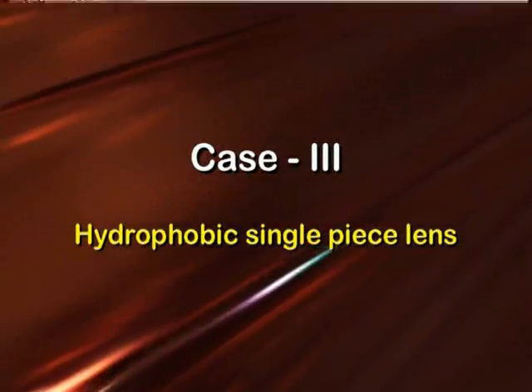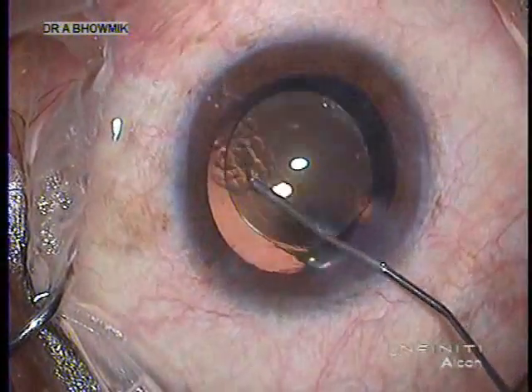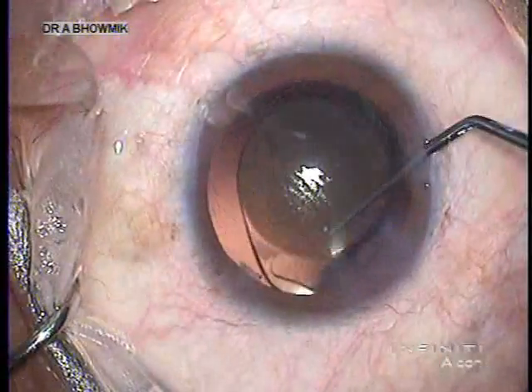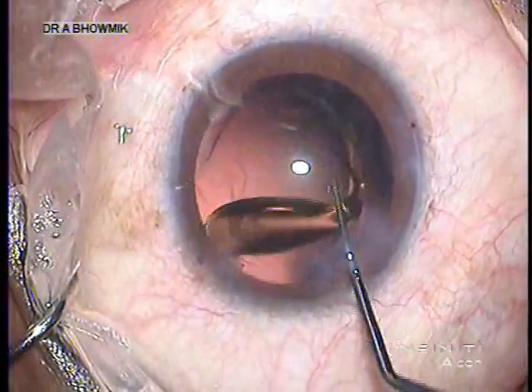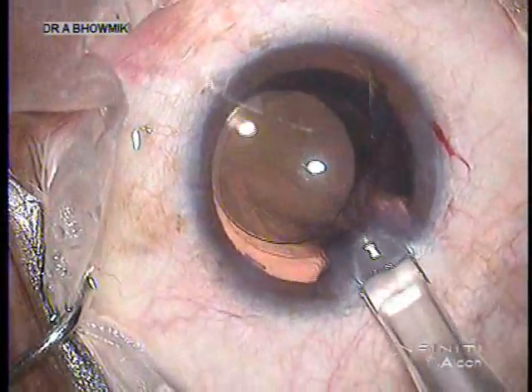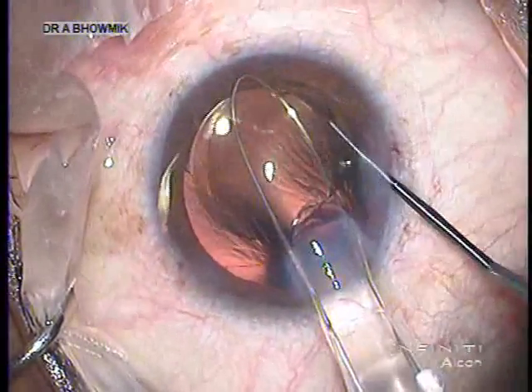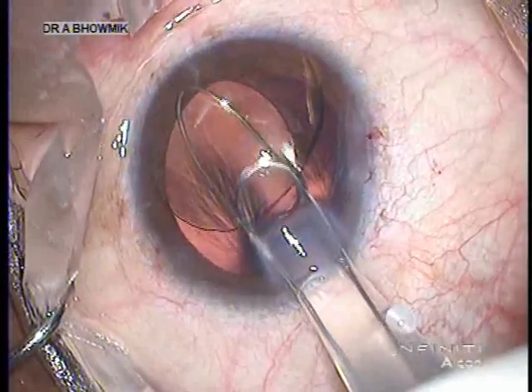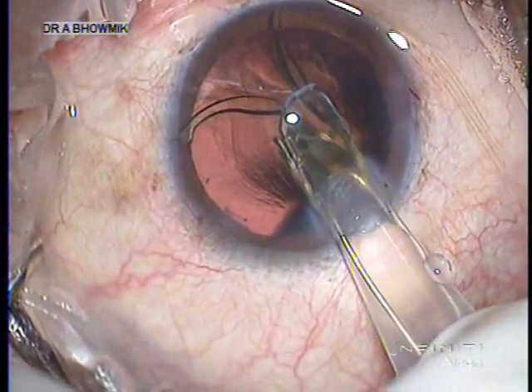A grossly inaccurate biometry led to the explantation of a one-day-old hydrophobic lens. The same corneal tunnel was reopened. Viscoelastic was introduced into the anterior chamber and within the bag to separate the lens from the posterior capsule, and the lens was prolapsed into the anterior chamber. The modified cartridge with the snare was prepared and introduced. A Sinski hook engaged the lens into the snare loop — it is very important to keep the tip of the cartridge in the anterior chamber as it requires more space to open. With gentle pulling of the snare, the lens obediently refolded and was explanted through the same cartridge.